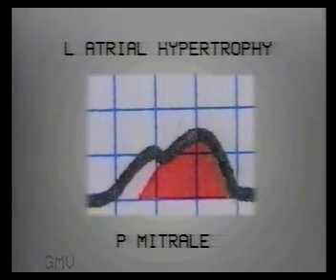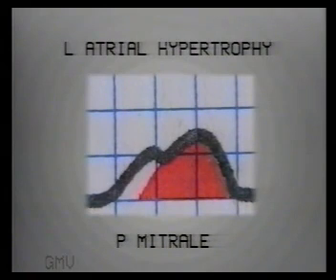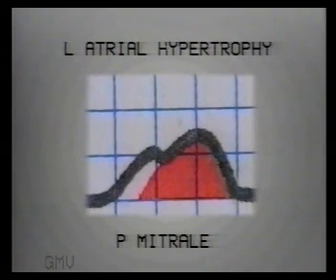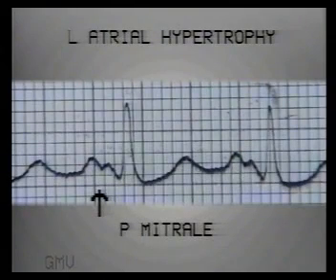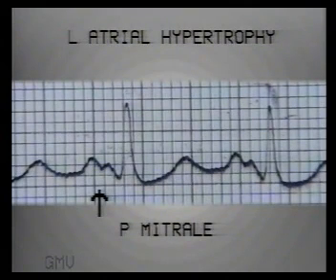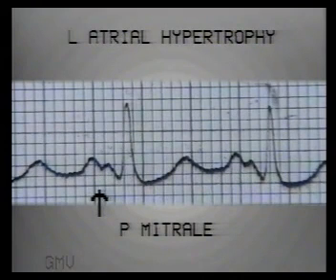In left atrial hypertrophy, the second component is delayed and prominent, producing a wide and notched P wave wider than 2.5 small squares. Since this is common in mitral valve diseases, it is termed P mitrale. Note the P mitrale shown: notched and 3.5 small squares wide — width more than 2.5 squares is the main criterion.